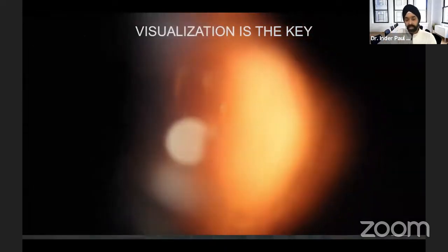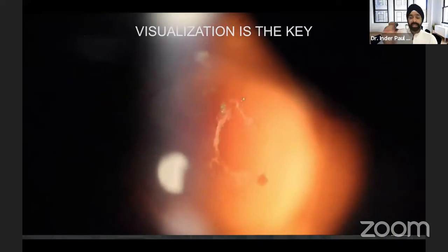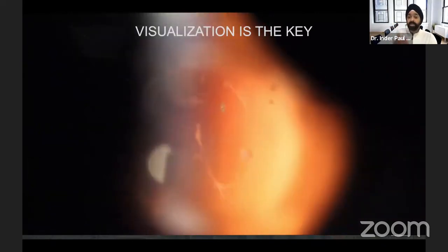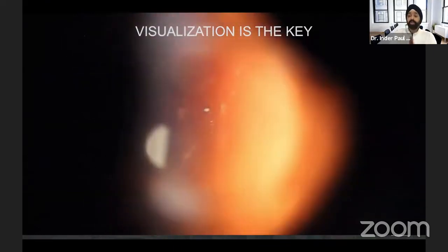This is one more example here, then we'll move forward. Another Weiss ring. Again, these are beautiful views that we see because of the coaxial illumination. Again, no matter what lens you use, if you do not have coaxial illumination, you will not have the ability to actually see these kind of floaters and this type of a view. Again, the retina is out of focus and the floater is in focus. I know I'm safe. And this is exactly what we need to utilize. Other standard YAG lasers will not give you this. This is why now we feel safe to perform this procedure and we can identify floaters that we could not identify in the past. Very important.